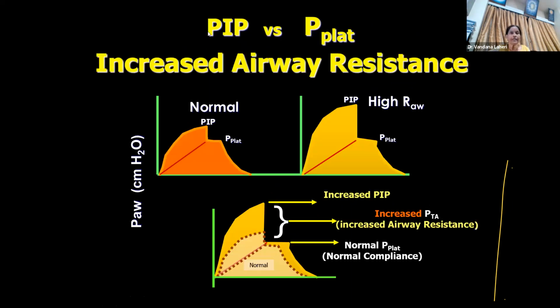Now let us see PIP versus P plateau. I told you what is PIP. I told you what is P plateau pressure, right? So let us see if this is normal. Now what has happened here?